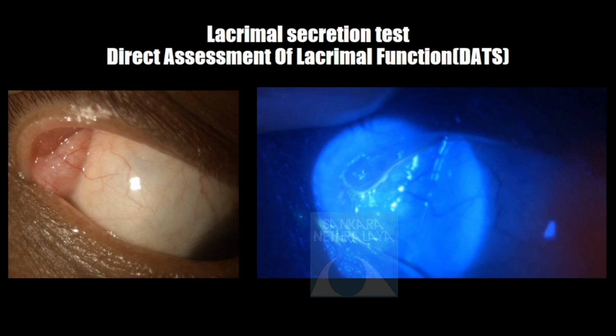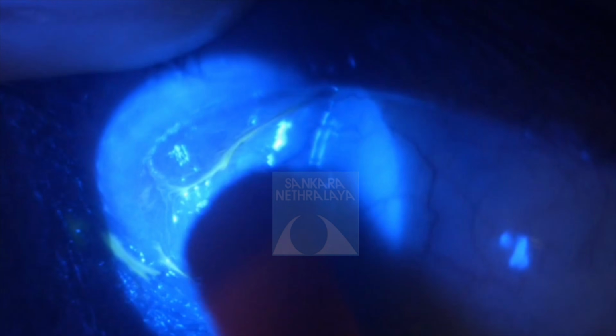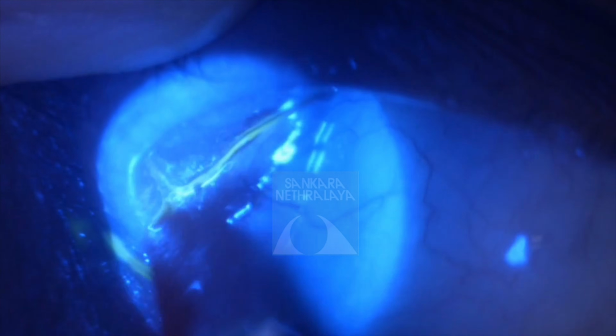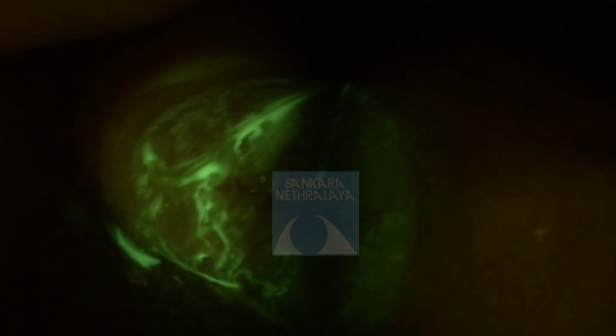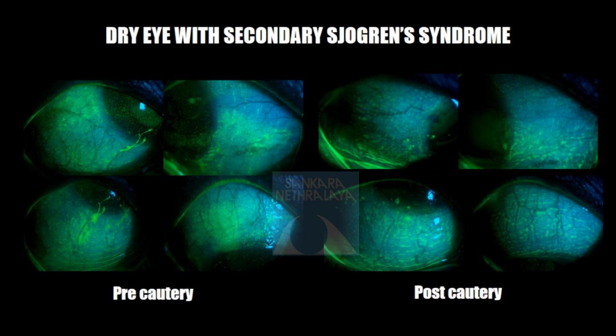In direct assessment of tear secretion, fluorescein dye helps assess real-time lacrimal gland function by highlighting the tear production. To perform this test, stain is gently applied to the superior palpebral conjunctiva near the lacrimal gland opening. The patient is asked to blink normally. The appearance and movement of fluorescein-streaked tears on the ocular surface is observed. The timing, length, and intensity of the fluorescein trail help assess the real-time secretory response of the lacrimal gland.